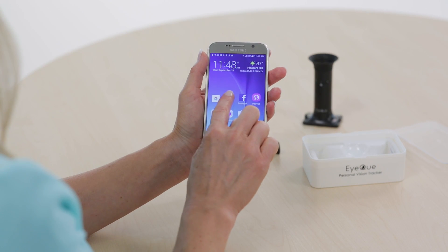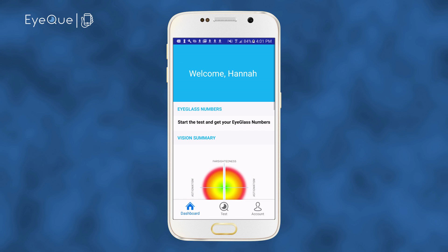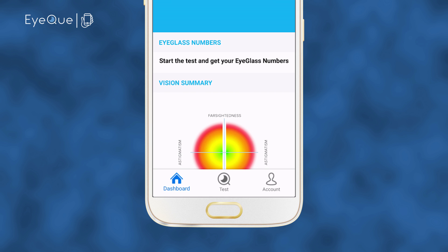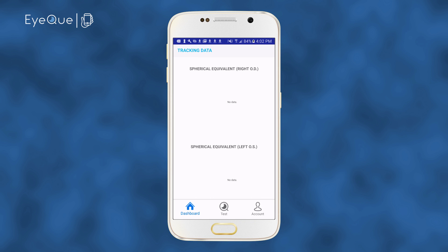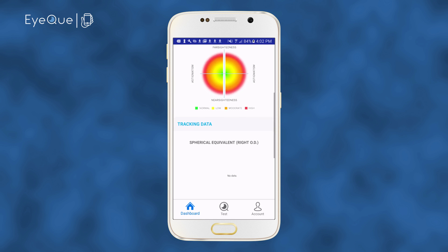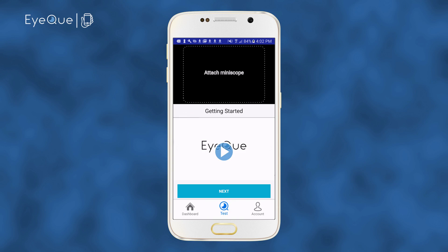Launch the MyIQ app on your Android or iOS smartphone and log in to your account. At the bottom of the welcome screen, you'll see three tabs labeled Dashboard, Test, and Account. The Dashboard is where you'll find your testing progress and view eyeglass numbers along with advanced vision summary and vision tracking. Before completing your first test, your dashboard will be empty. Click on the Test tab and you'll be taken to the Getting Started page. You can review this tutorial video by clicking on the Video Play button over the IQ logo.